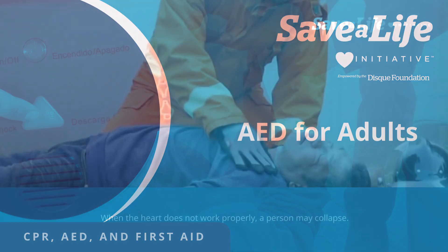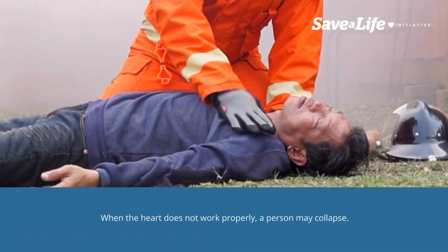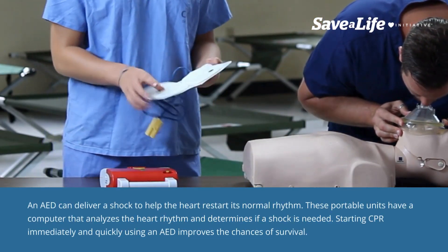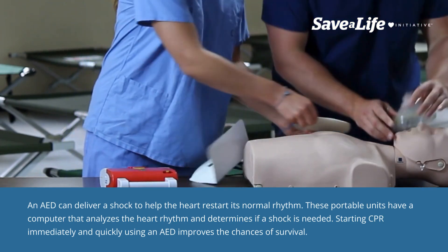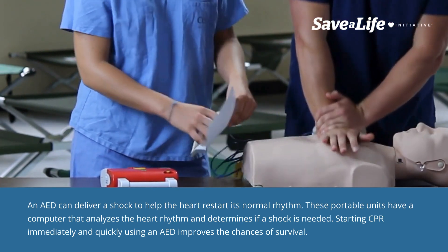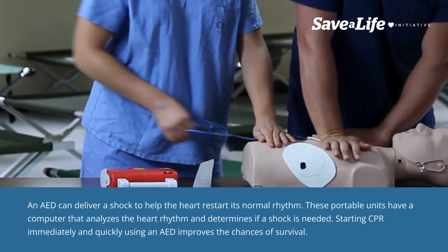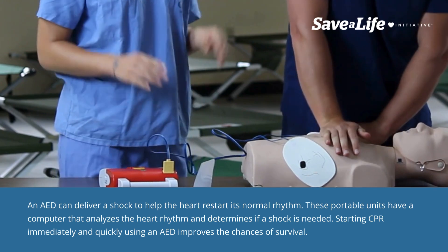AED for adults. When the heart does not work properly, a person may collapse. An AED can deliver a shock to help the heart restart its normal rhythm. These portable units have a computer that analyzes the heart rhythm and determines if a shock is needed. Starting CPR immediately and quickly using an AED improves the chances of survival.